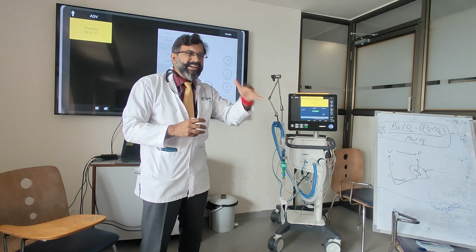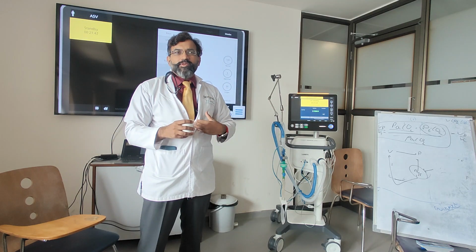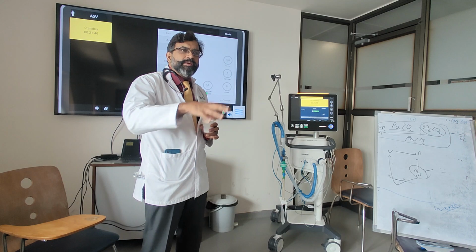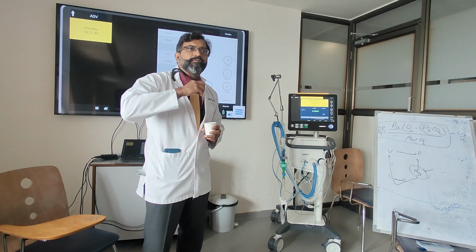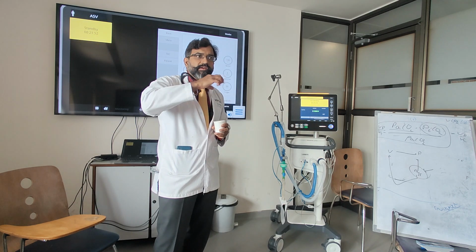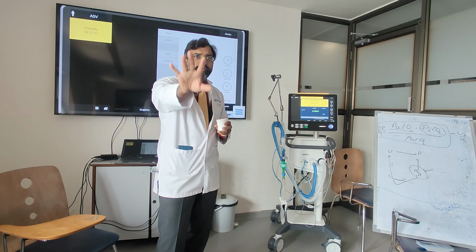You want that patient to first settle down. So in cardiac surgery, because the FRC is on the lower side and the sternotomy is open, you may not get the right values. My experience has been that cardiac surgery patients put on ASV don't do well. They have longer periods of weaning. The machine never matches the weaning tendency. So basically, cardiac surgery, avoid.